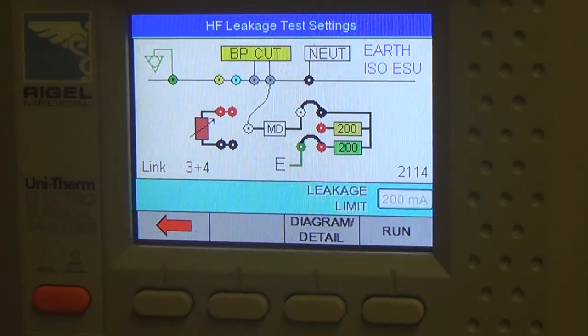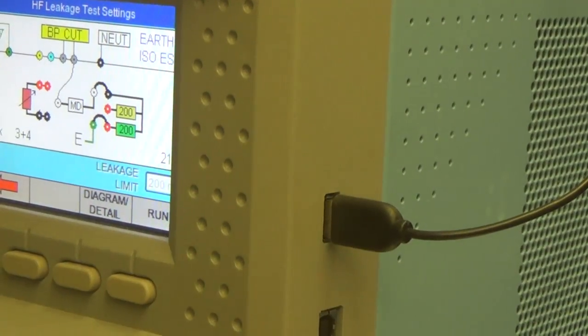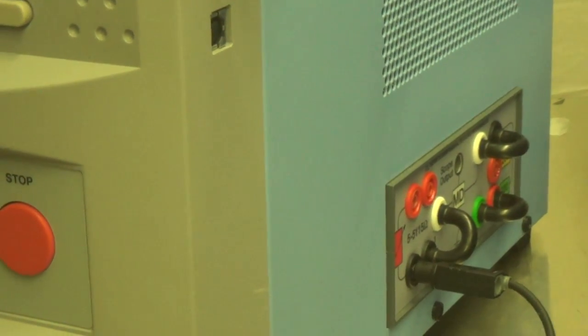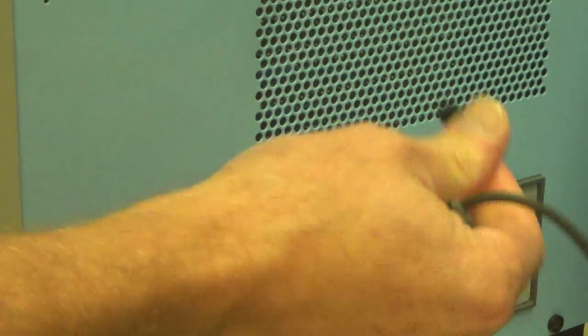This is a different diagram. This diagram here is suggesting what happens if one of the bipolar forceps or bipolar tool fails and it's the left tine that fails. So we disconnect the left tine and we move, so we don't need this jumper.